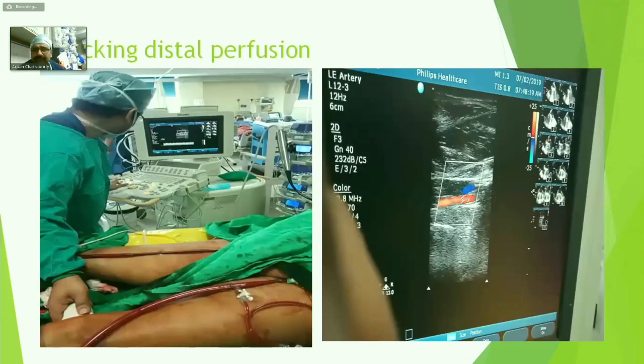And the way we check the distal perfusion, I've shared it many times, even on social media. We check the distal perfusion by changing the knob, changing the three-way with the perfusion, the distal perfusion flow, and we check a flat line of flow which is going through the same limb, which is given by the artery.